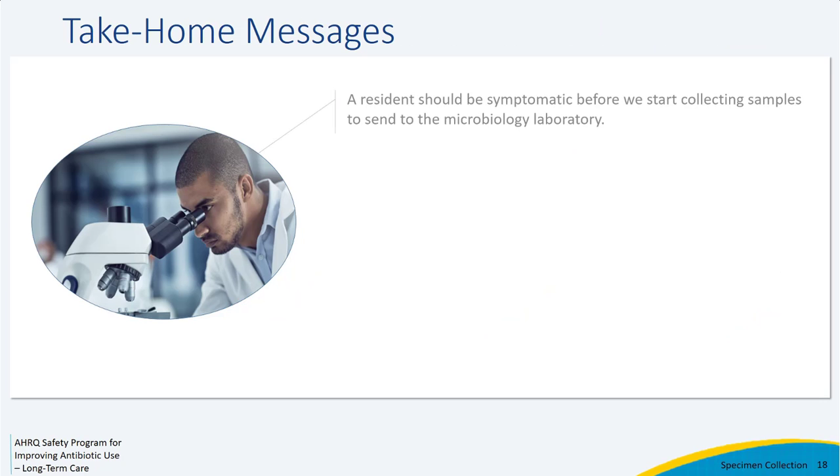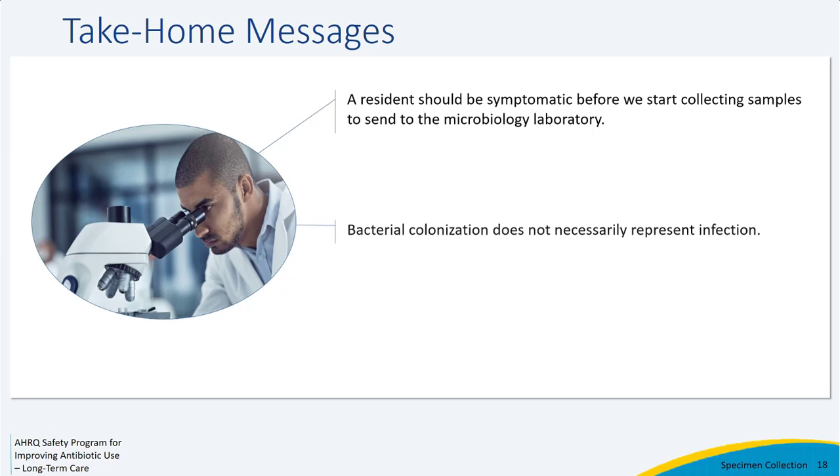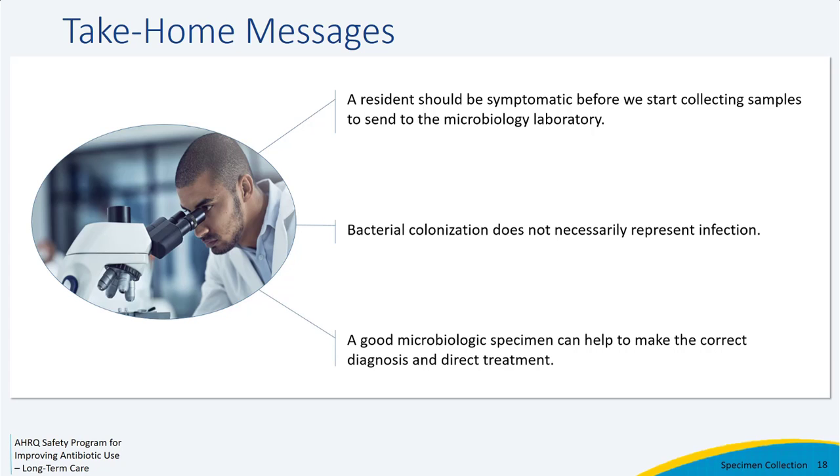Here are some general take-home messages from this culture collection module. A resident should be symptomatic before we start collecting samples to send to the microbiology laboratory. Bacterial colonization does not necessarily represent infection, and a good microbiologic specimen can help make the correct diagnosis and direct treatment. So following the correct procedures and sterile techniques is very important for the well-being of your resident in your facility.